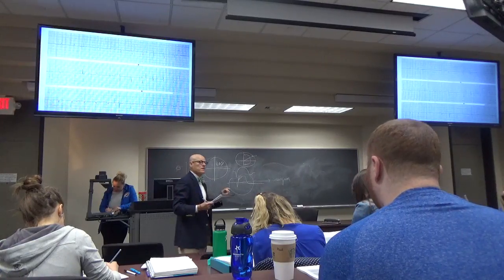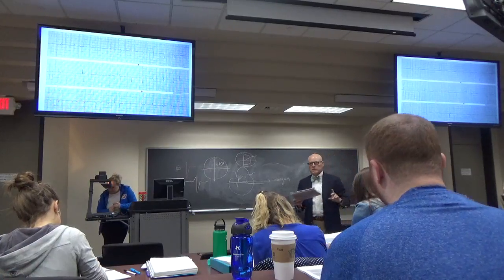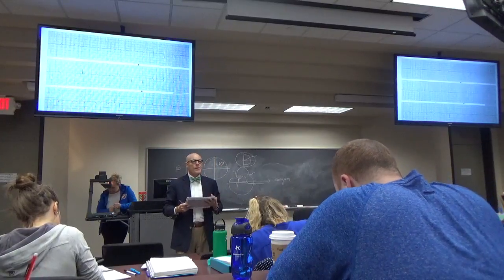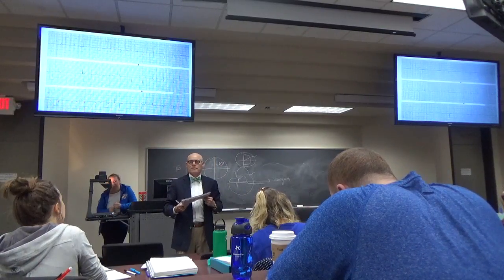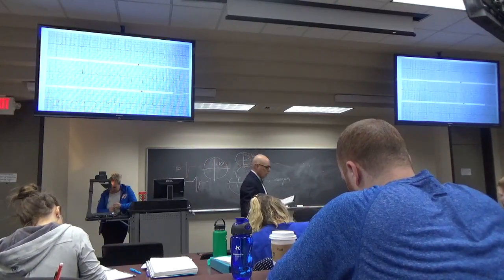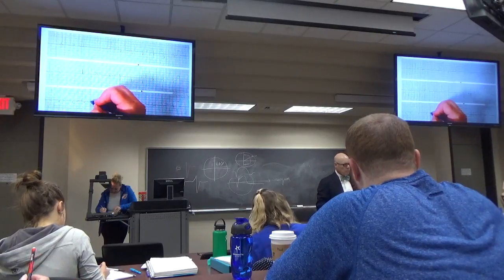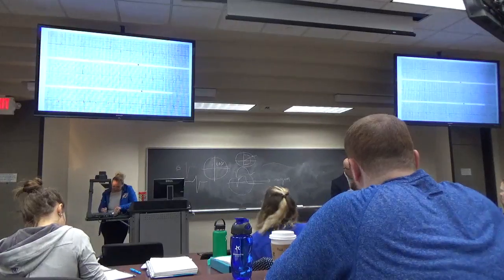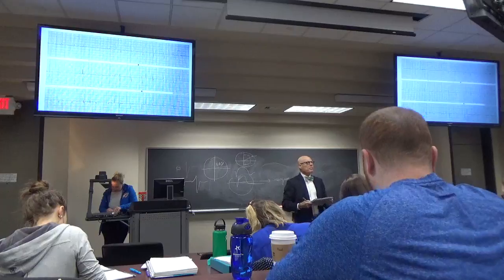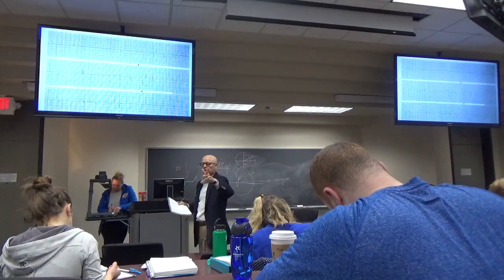Did anyone find anything else on the EKG? Prolonged QT. Yeah, the QT's kind of long. What did you say it was? I got 0.40. What did you get? 0.44. So it's a little long, and if you called this a prolonged QT, it would be reasonable. We said 0.44, 0.47. As a man or woman, we don't know which it is.